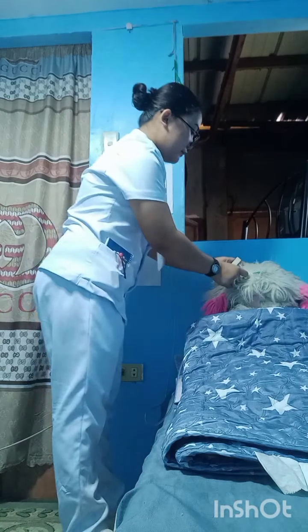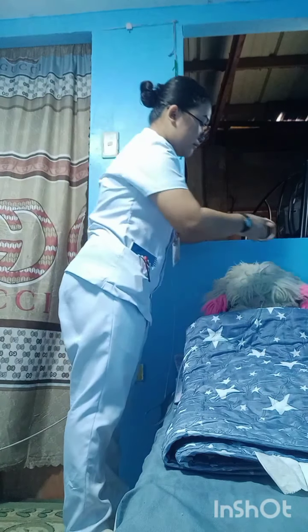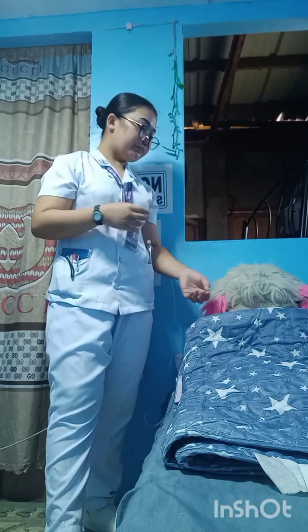For the next one is we're going to pad the tubing and band over the ears and the cheekbone of the patient as needed.